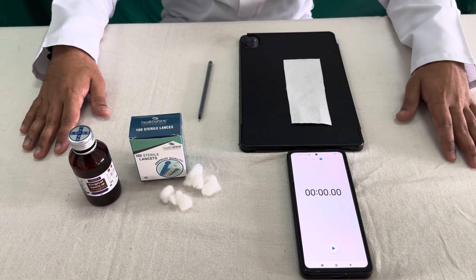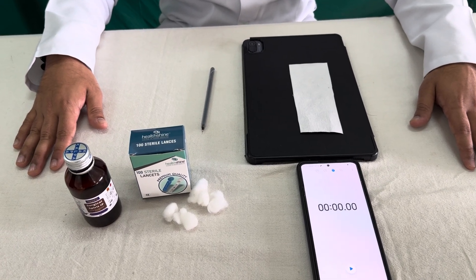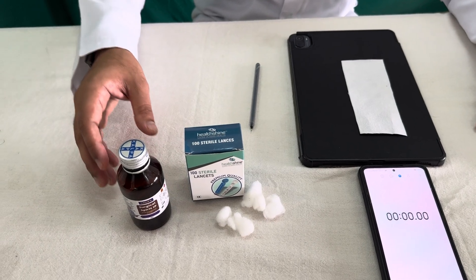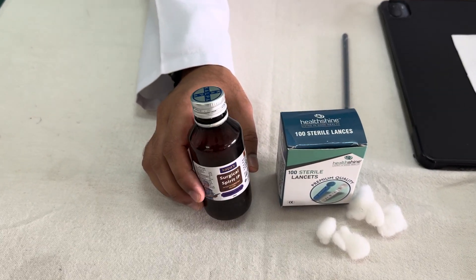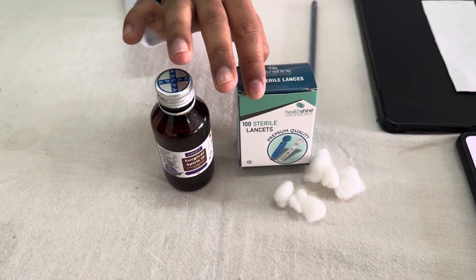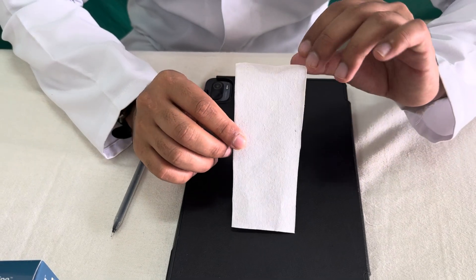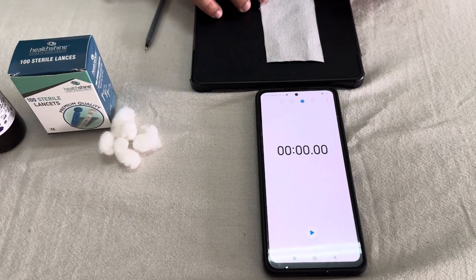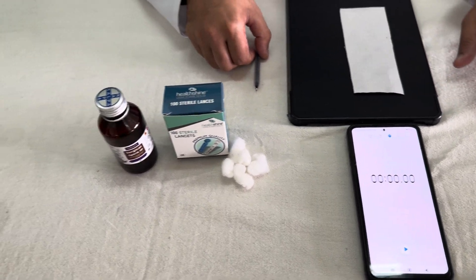Hello friends, today we will do the practical or the procedure for determination of the bleeding time by Dukes method. First, what are the requirements? We need equipment for sterile finger puncture: surgical spirit, lancets, and cotton swabs or gauze. Then the most important one is either filter paper or blotting paper, then a stopwatch — you can use a mobile phone or even a wristwatch, whatever is available.